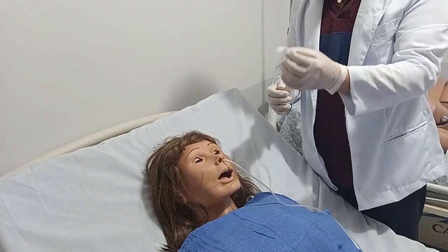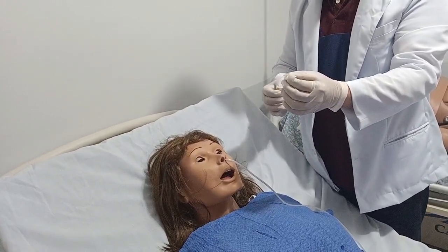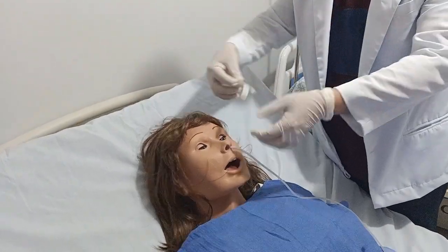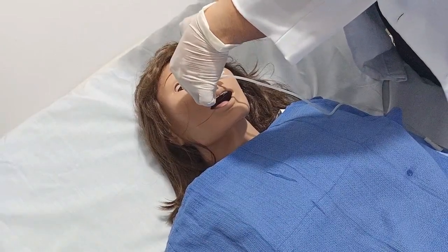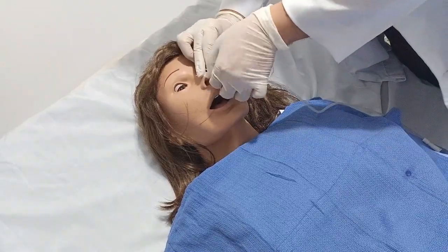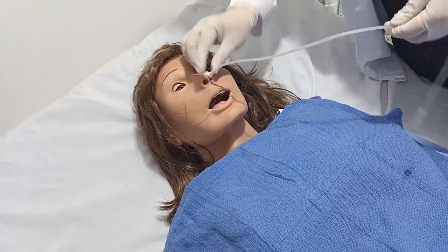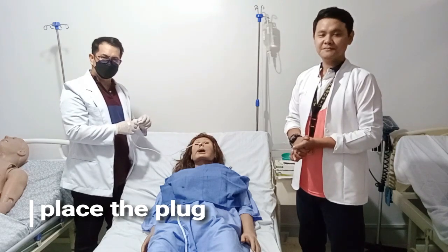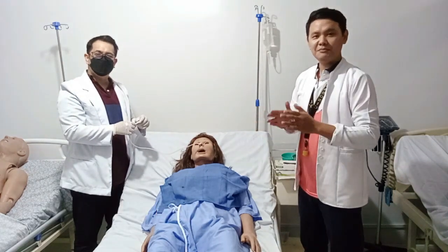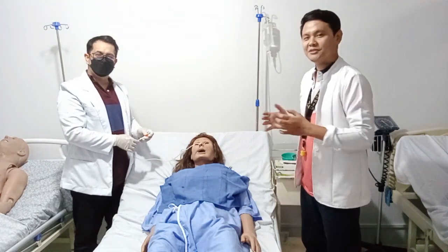Secure the tube by taping it to the bridge of the client's nose. You can use a 1-inch micropore tape cut in half — that will be used as an anchor for the NGT. After securing the NGT, place the plug at the end of the nasogastric tube. After all procedures, evaluate the client's response, and lastly, document all the information in the client's chart.